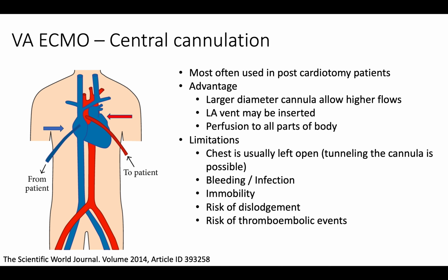As the vessels are directly accessed, cannulas are inserted at most a few millimeters to 1 or 2 centimeters into the vessels. Hence, there may be a higher risk of cannular dislodgement. Often clinicians use deeper sedation plus or minus paralysis when central approach is used for the perceived risk of accidental decannulation. Another disadvantage is that in the case of ECPR, central cannulation risks frequent interruptions in CPR.